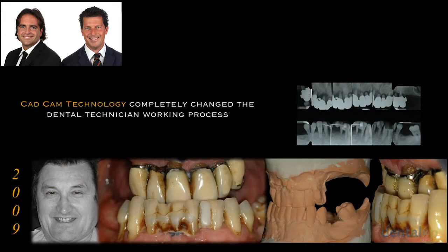As an example, let's consider this case restored in 2009, where new technologies and new materials were getting more and more inside the treatment plan. Complex case rehabilitation with a high functional issue due to its pronounced third class, periodontal and aesthetic problematics, a very challenging case.